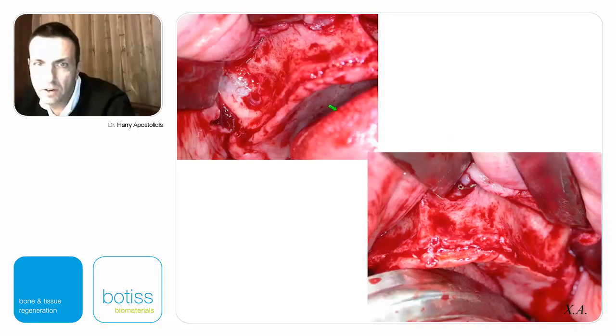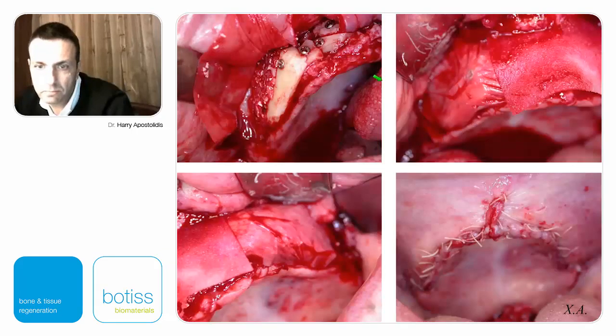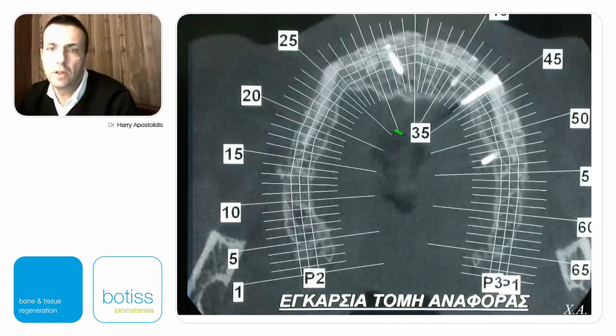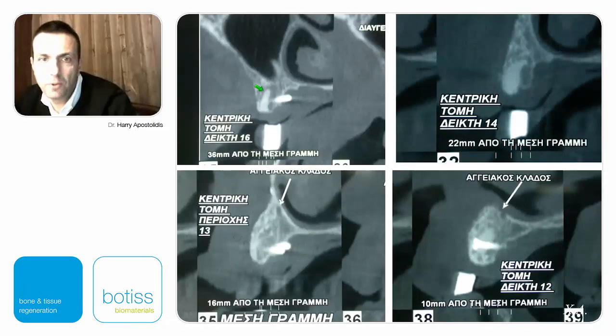You're going to see it now here. Here you see the palatal flap stayed on the bone. I didn't raise that. So blocks all around, and our xenograft granules, autogenous scrapings, pinned, stabilized membranes, tension-free closure, and 6 months after that, look at the bone that we have to place an implant in tooth number 1-6, tooth number 1-4, tooth number 1-3, 1-2.